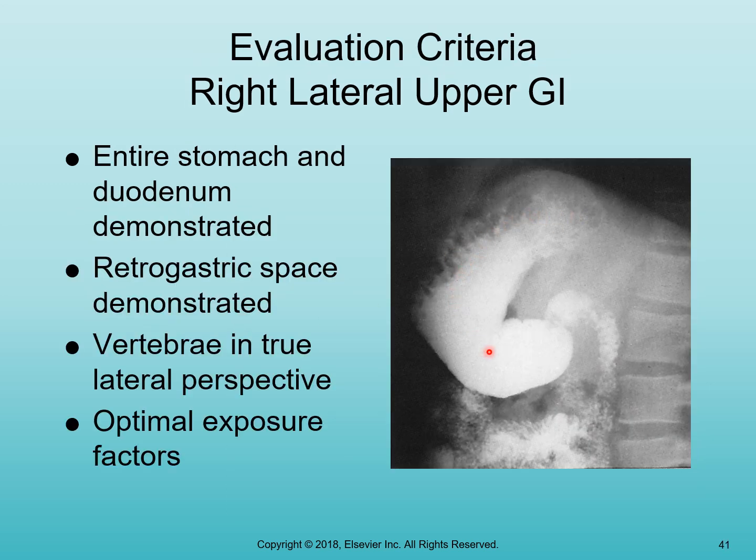So when it falls forward like that, instead of centering right in the middle, the mid-coronal of the patient, you actually are moving the central ray 1 to 1.5 inches anterior to mid-coronal. Okay, because you can see how the barium kind of fills and makes the stomach fall forward. Here's the spine, nice and straight, and the barium causes the stomach to fall forward because it's heavy.